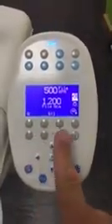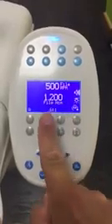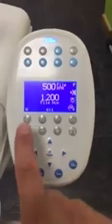You can program these endo settings in exactly the same way as you can with the standard motor settings. On the 500, you've got these four memories here. So let's say this was a memory setting that I wanted to use quite regularly. I could press P for program, M1 for memory 1, and now every time I press memory 1 in endo mode, I will be given this configuration of a 6:1 handpiece, file speed of 500 RPM to a maximum of 1.2 Newton centimetres of torque.